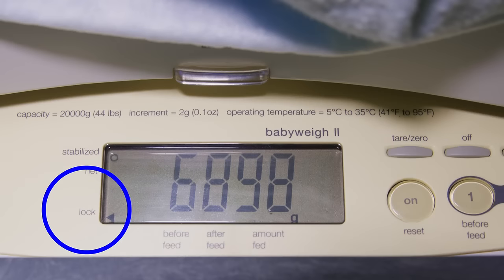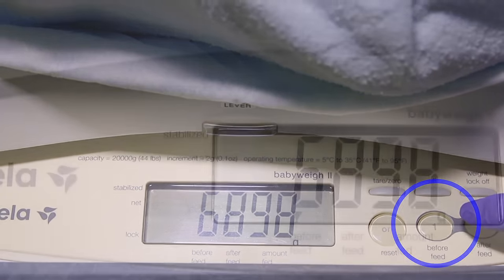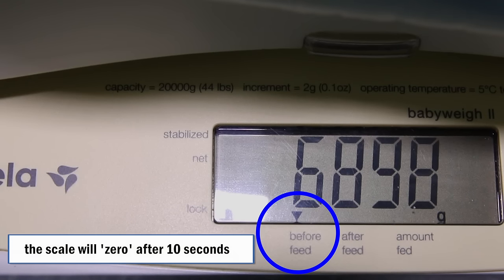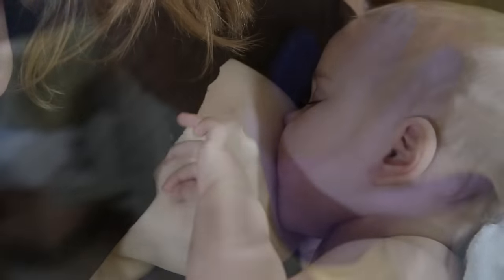Wait for the beep and arrow to appear beside the lock on the screen. Press 1 immediately to record the weight. The arrow will move to 'before feed.' It is important to press 1 to record the pre-weight while the infant is still on the scale, because once the infant is removed, the scale will zero after 10 seconds. Remove the baby from the scale for the feed.